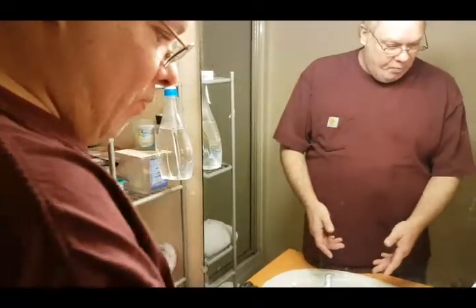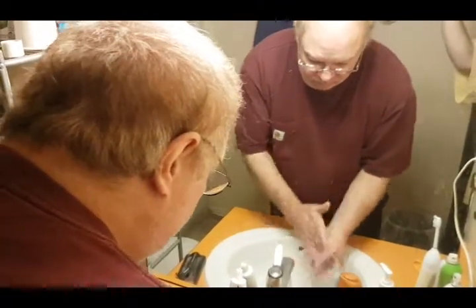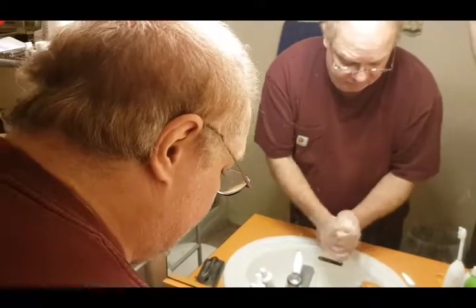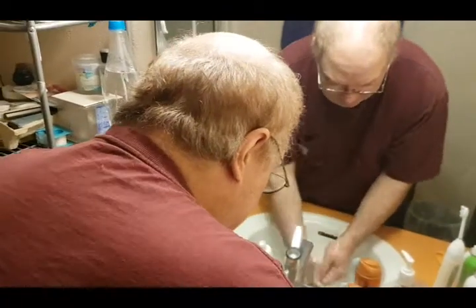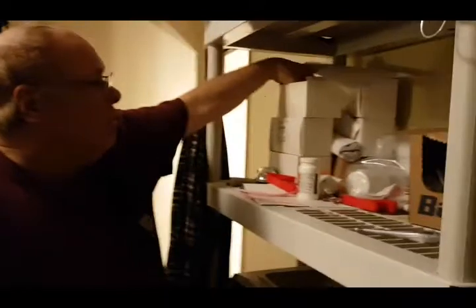So, aseptic is hot water, soap, and you wash your hands really well. After being on dialysis for so long, my hands are no longer like a brick, rough and calloused. Pat dry with, they say, a sterile towel. Again, this is residential. We're talking aseptic. Then the mask.